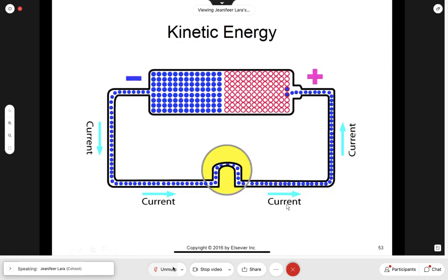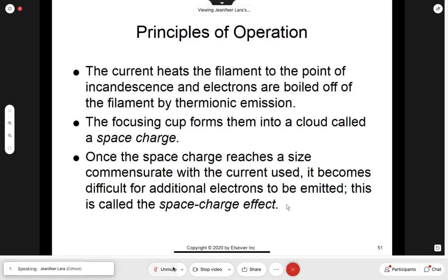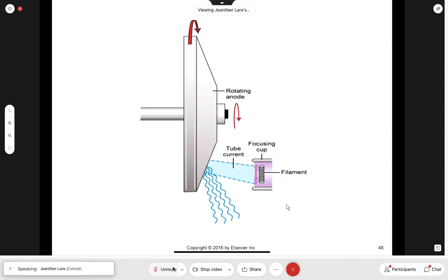No, I took out the part where it talks about the anode. I think we were still here. So once this becomes charged, the anode is going to be charged on the second phase, and that is what's going to drive the electrons over into collision. So first phase, the induction motor is going to spin the anode disc.